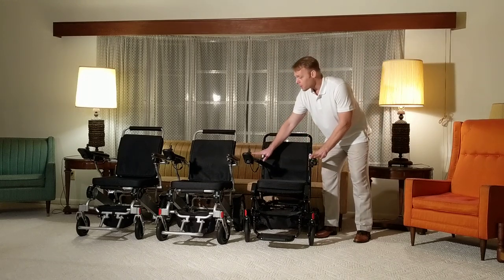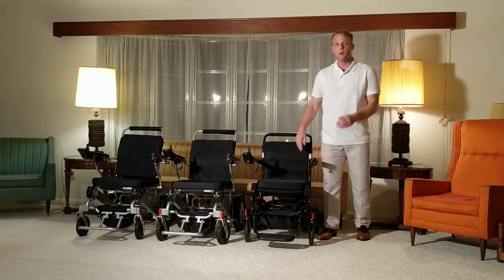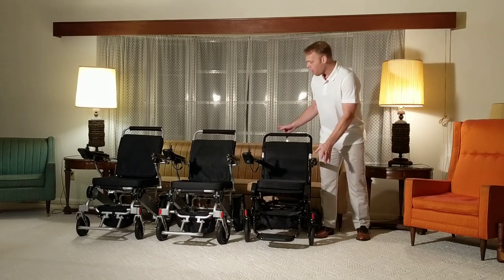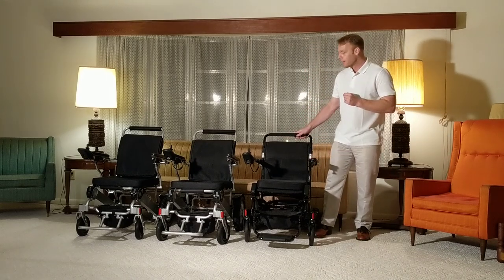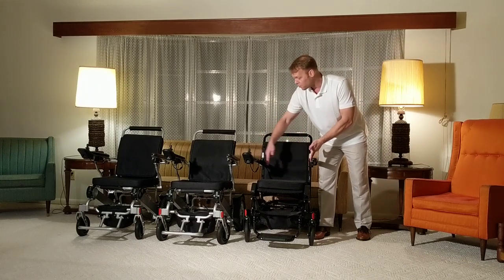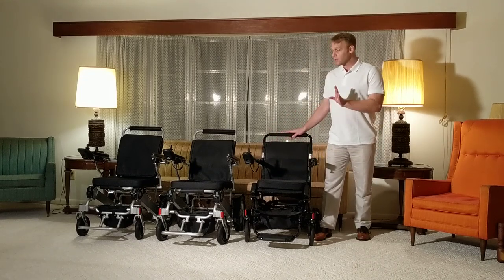The Airhawk without the batteries — and you can see the batteries are in the arms of the chair and slide out very easily — weighs just 41 pounds. It very easily folds up, and has approximately 19 inches of space between the arms in the seating area. It's very easy to use.